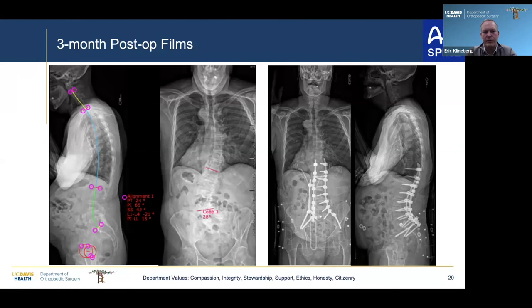Sorry. I think you use a little bit beefier screws, and, you know, you use titanium, but you still use a thicker rod than most people do. Yeah, these are 6.35 rods, cobalt chrome. Yeah. And what else? I mean, the surgical map, just kind of planning it out.